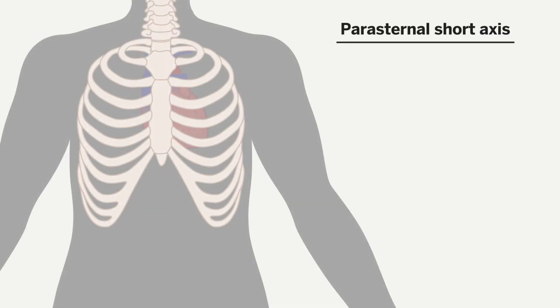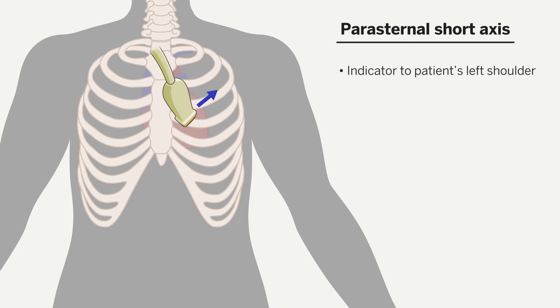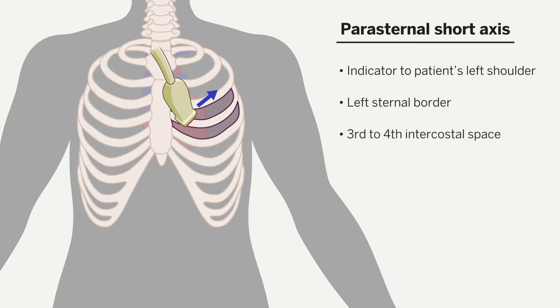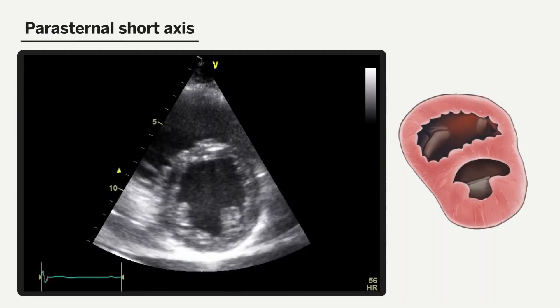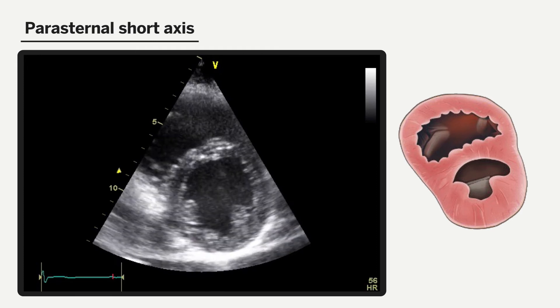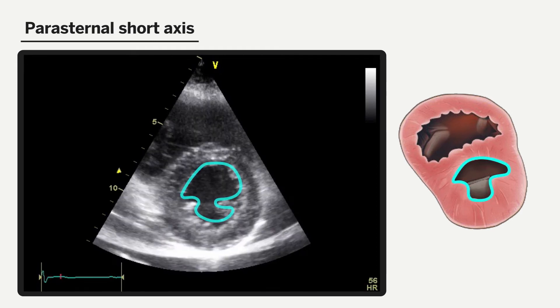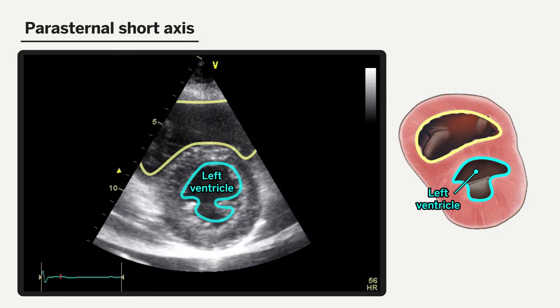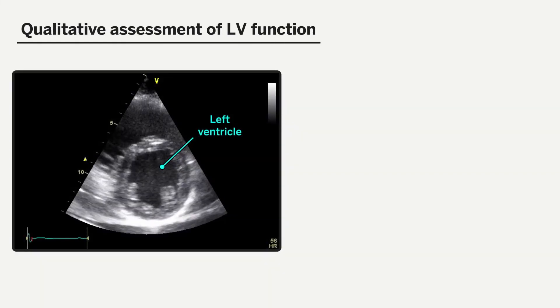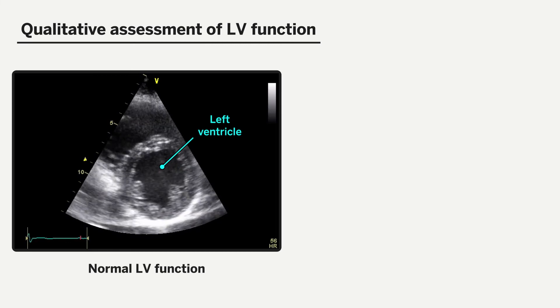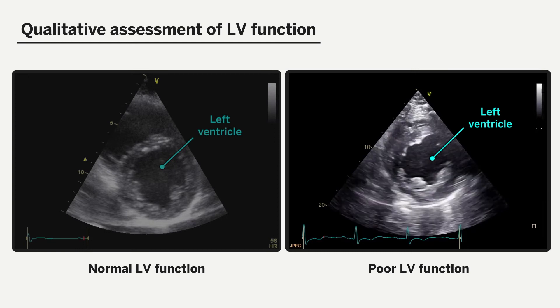Our next view is the parasternal short axis. To obtain this view, we rotate the probe from the parasternal long axis position so the indicator is now facing towards the patient's left shoulder, remaining left of the sternum in the third or fourth intercostal space. Our standard view should show the round or donut-shaped left ventricle along with the crescent-shaped right ventricle wrapping around it. This view is useful for qualitatively assessing left ventricular function by eyeballing contractility, with good function on the left compared to poor function in the video loop on the right.